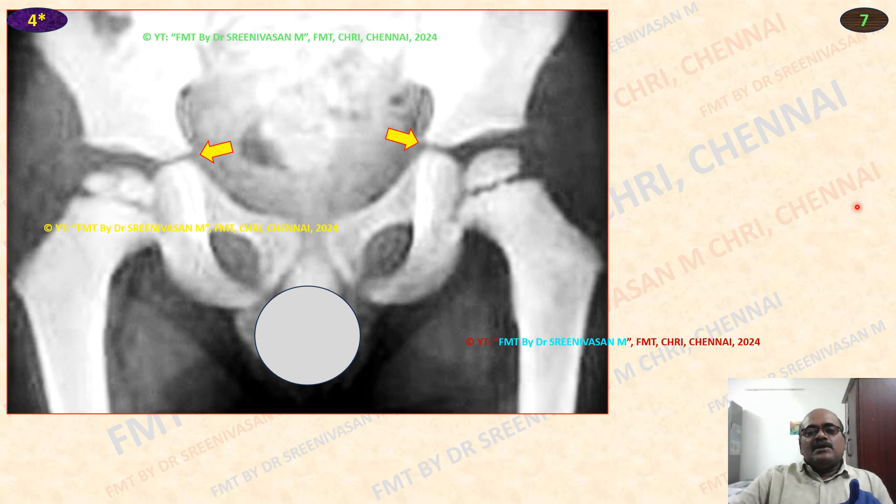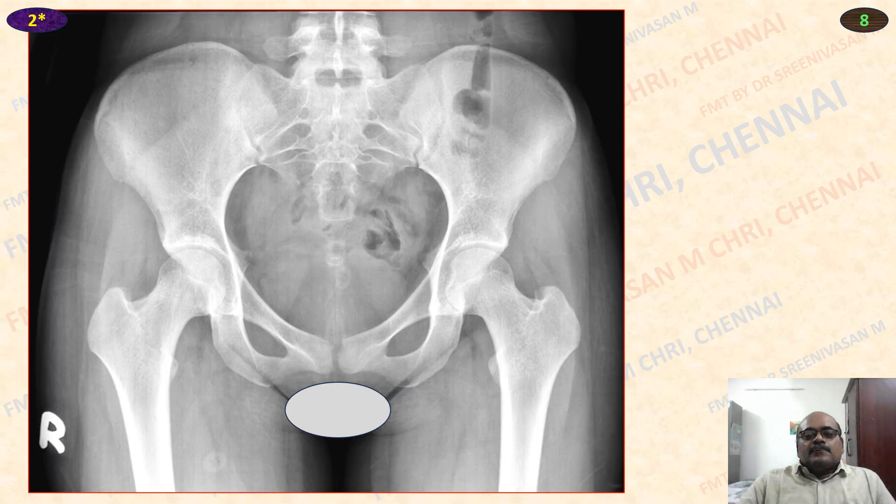This arrow indicates the tri-radiate cartilage not fused. Look at the acetabulum medially for any discontinuity — even a small discontinuity, keep it as not fused. So in this X-ray, you can see the head of the femur, greater trochanter, lesser trochanter — all have appeared as well as fused. So age is above 17 years.